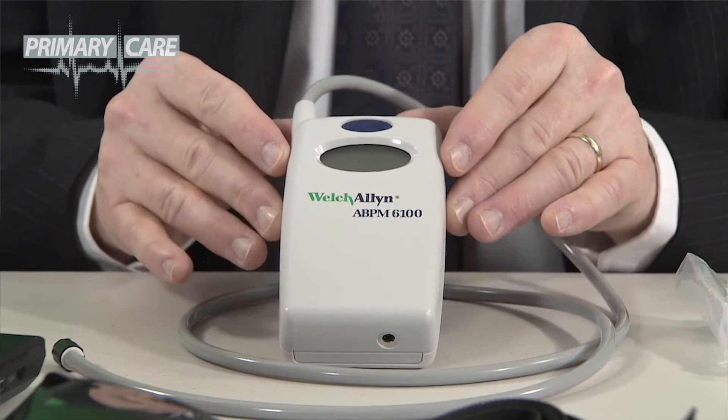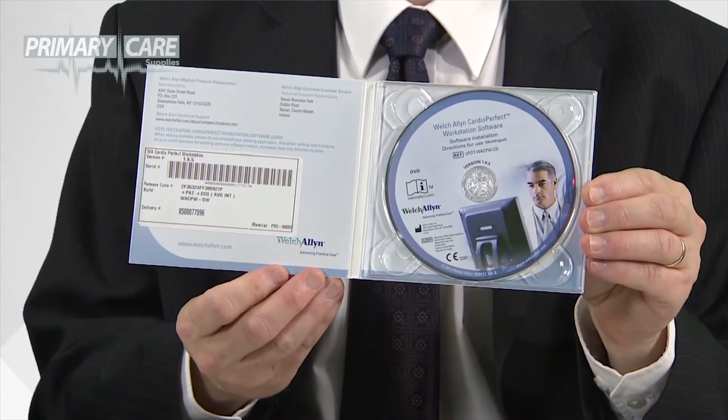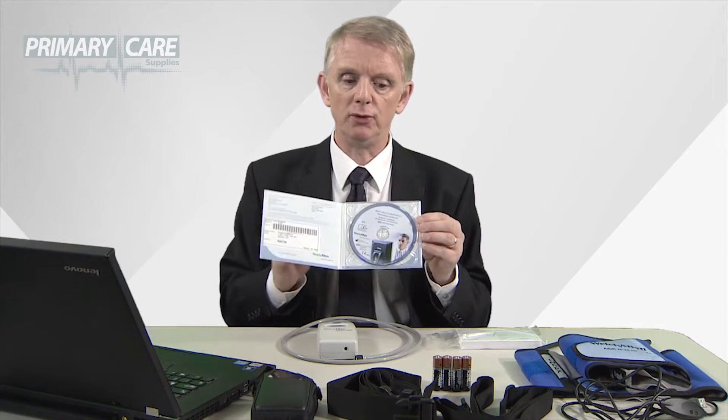The ABPM unit comes with the unit itself, optional patient diary cards, CardioPerfect software which would need to be downloaded to your PC or laptop in order to perform the tests, and 2 cuffs — adult and large adult.